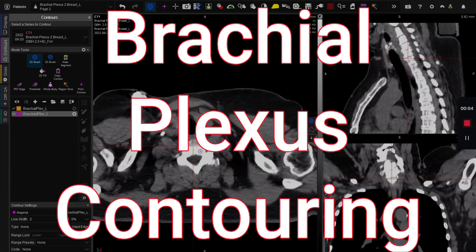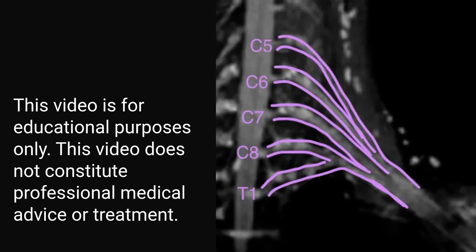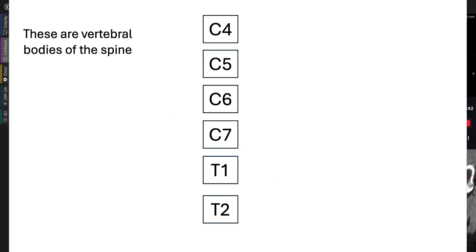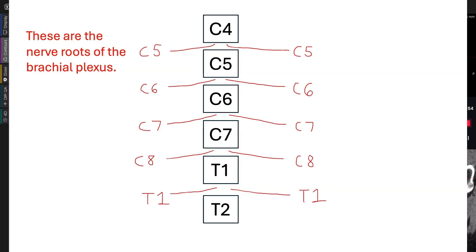What is up YouTube? Good to see you, and today we're going to focus on contouring the brachial plexus. This is an OAR that we commonly see when we're doing thoracic disease sites or head and neck, and I want to make this easy, fun, and intuitive so you and your entire team can be doing contouring in less time with higher quality, ensuring safe treatments for your patients. Contouring the brachial plexus is strangely rewarding when you get it done right, so you may even find yourself looking forward to those cases. Let's get into it.